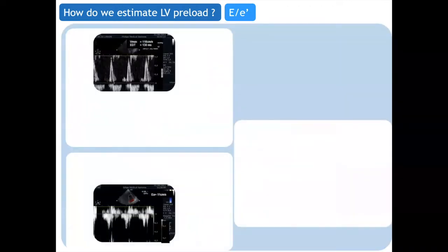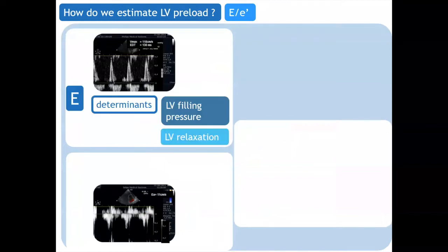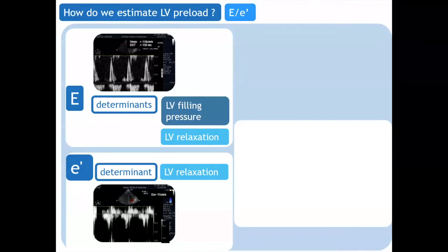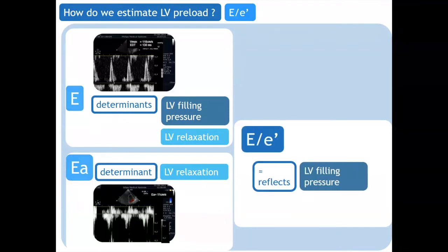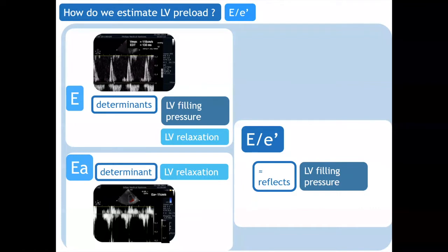At the same time as the E and A waves, we have E' and A' waves — and also an S wave — reflecting the velocity of the mitral annulus. By convention today, we speak about the E' and A' waves. Now, the E wave is determined by LV filling pressure and LV relaxation, but the E' wave is determined only by LV relaxation. So if we divide E by E', we have an index influenced only by LV filling pressure. By dividing E by E', we obtain an estimation of LV filling pressure not influenced by LV relaxation — this is why the E/E' ratio is the best bedside estimate of LV preload.